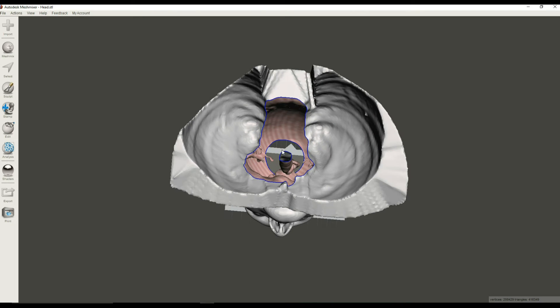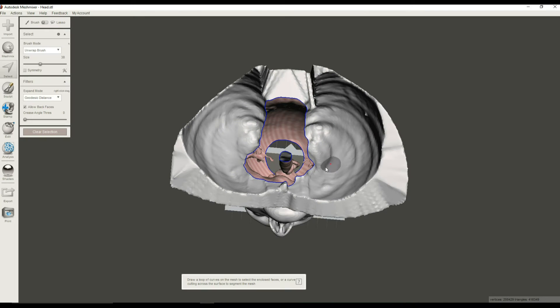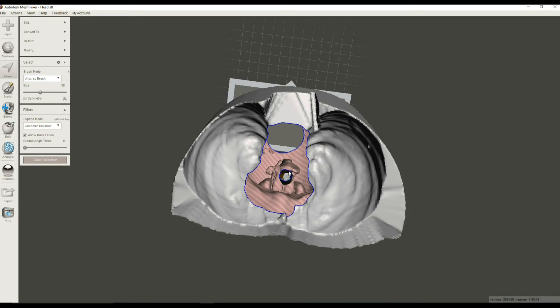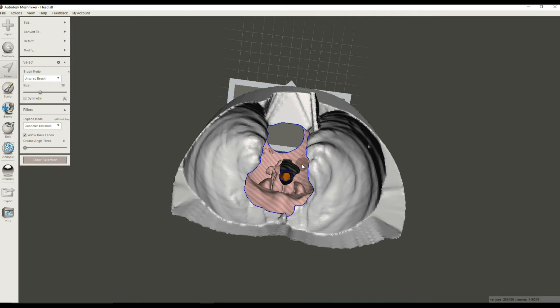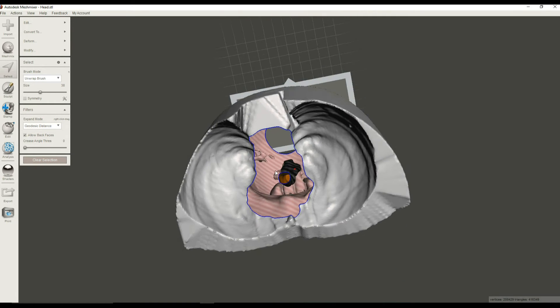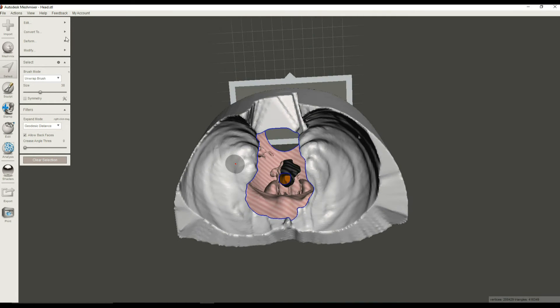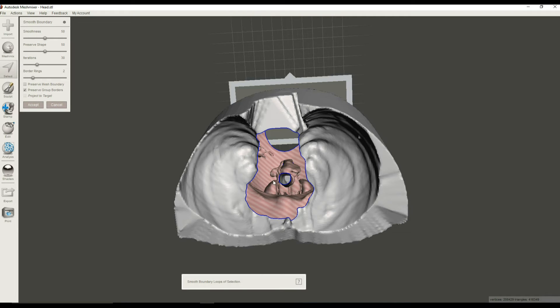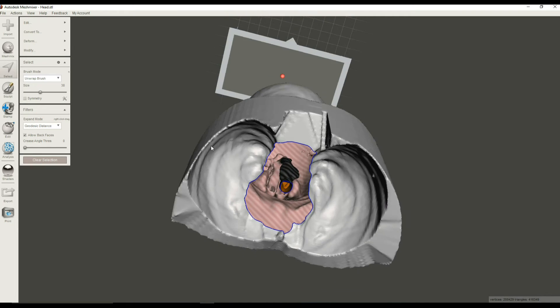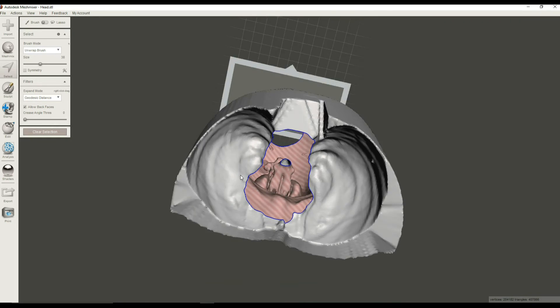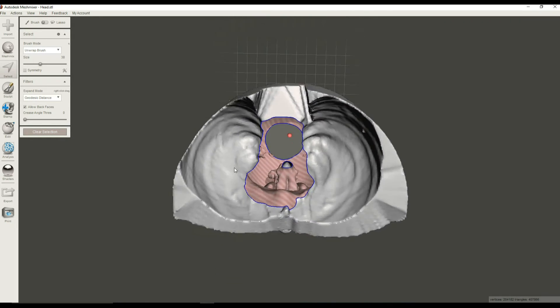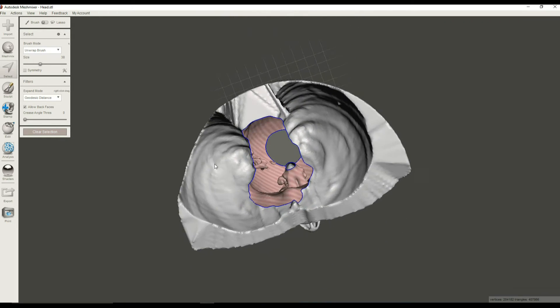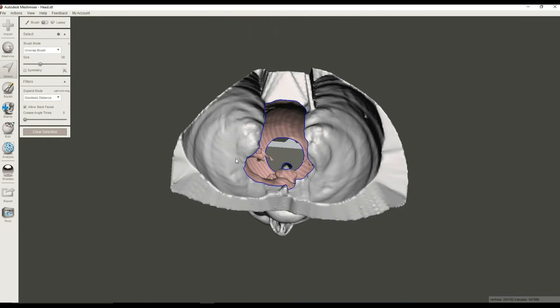Let's clear that. Let's try that again. Just select this stuff and expand that selection using the Shift and open caret key. And let's smooth that boundary, accept that, and we'll delete this structure. So hit the X key. There we go. So that's deleted. We still have the nasal cavity, but that's not too bad.